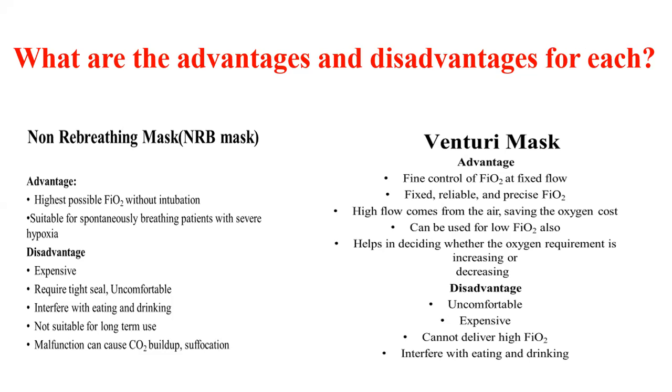As a disadvantage, Venturi masks are not very common. Patients are uncomfortable. It's expensive also, like other materials, to give a limited FiO2. Also, it interferes with eating and drinking, like the mask and the non-rebreather mask. Next slide.